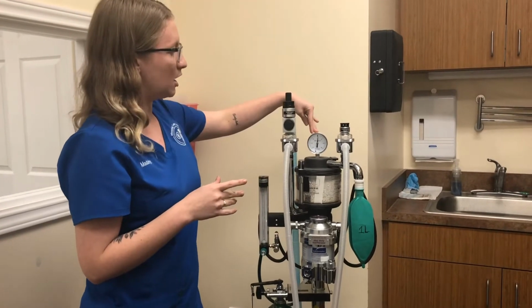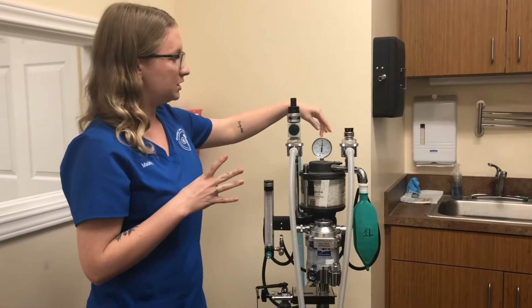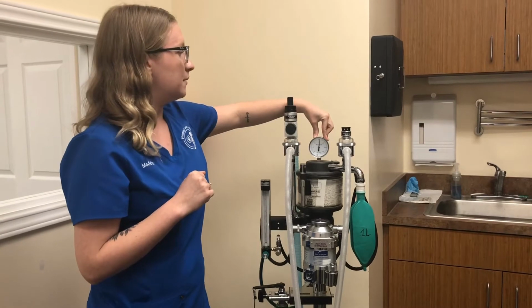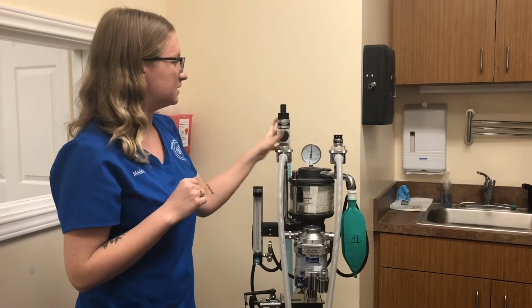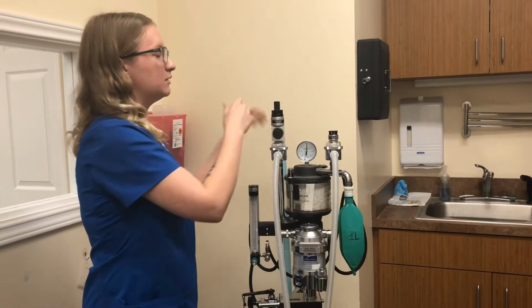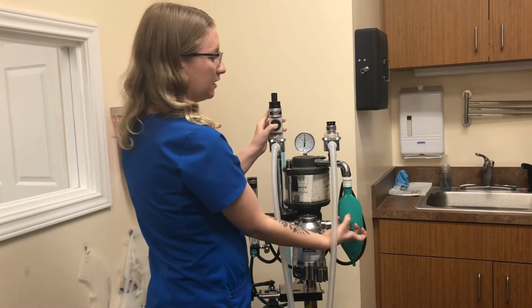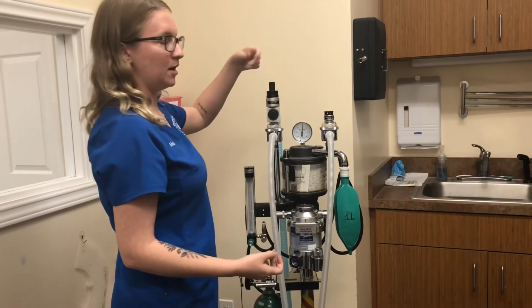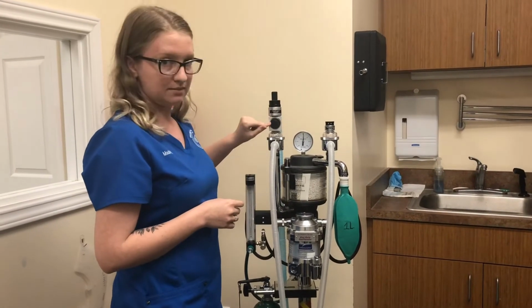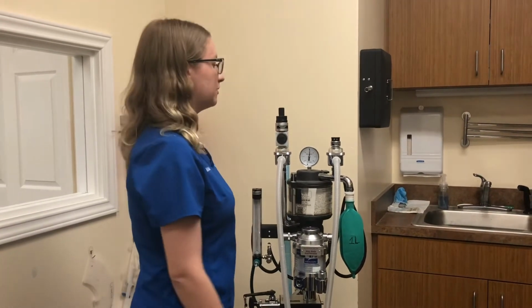You don't want to forget your manometer, and this reads centimeters of water. When you're breathing for a patient, you don't want it to go over 20 because that can cause harm to the patient's lungs. This specific machine has a safety feature, this button. When I press it, it's temporarily the same thing as shutting off this pop-off valve so that you can give your patient a breath. When you release it, it's like the pop-off valve is opening and it opens everything back up again. If my machine did not have this button, I would have to close the pop-off valve and then open it every time I'm giving a patient a breath.